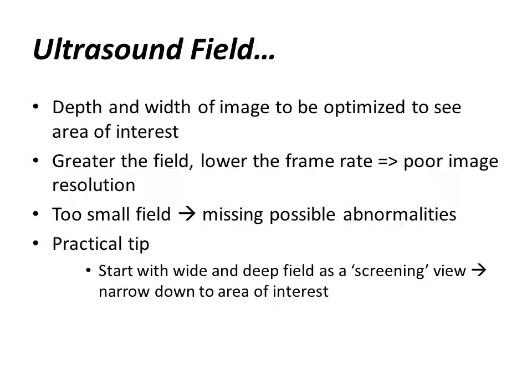Now, I should have discussed this in the basic ultrasound principles: if you scan at bigger depths, then you need a longer wavelength or a lower frequency, because with a lower frequency the waves are able to penetrate deeper into the tissue. Unfortunately, if you keep the ultrasound frequency low in order to reach deep areas, the resolution with these lower frequency ultrasound waves is not very good. So you may be able to scan deep, but you may not get a very good picture.